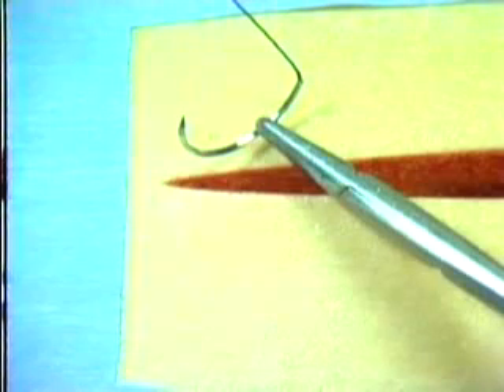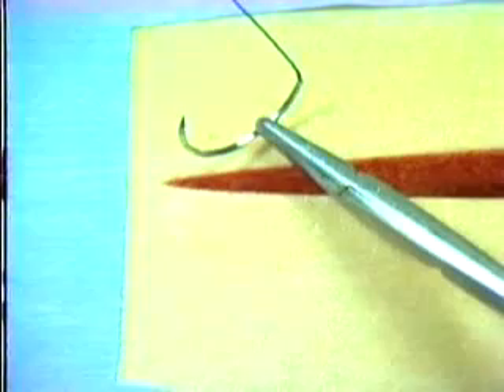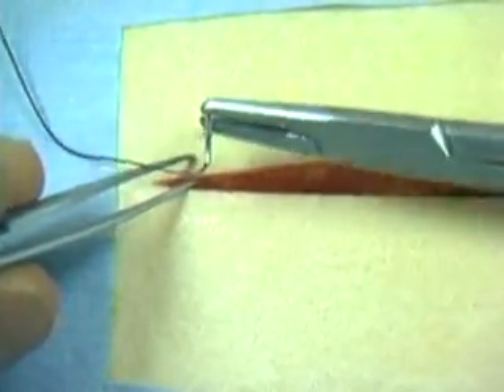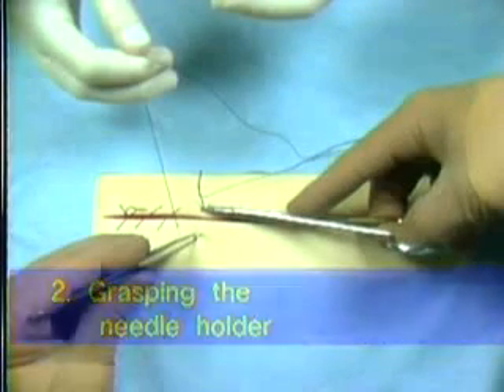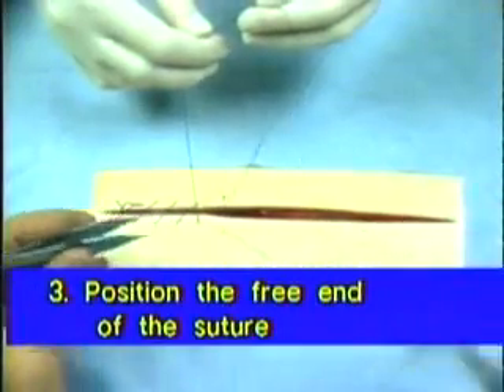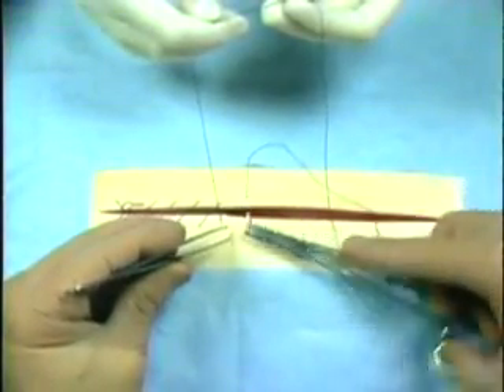And now the steps in placing a forehand stitch. First, the needle should be grasped perpendicular to the needle holder, so that it is driven through the tissue by rotating the holder on its long axis. Grasping the needle near its eye or swage works best for most soft tissue procedures — it allows maximum exposure of the needle point for re-grasping, but is more likely to bend or break the needle if the surgeon drives it forcibly through tissue. Second, the proper needle holder grip is used depending on the situation; for most small animal procedures, use the thumb ring finger grip. Third, try to position the free end of the suture strand opposite the direction you are suturing. For the forehand stitch, the end should be directed away from the surgeon or in the direction of your assistant, reducing the potential for tangling.